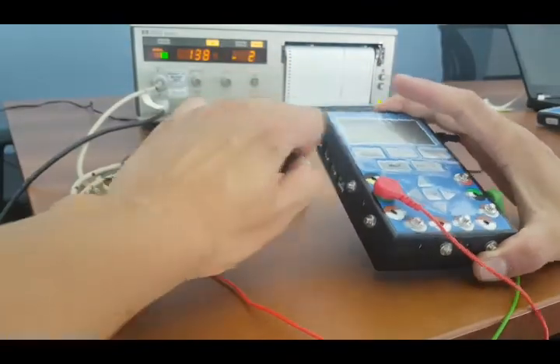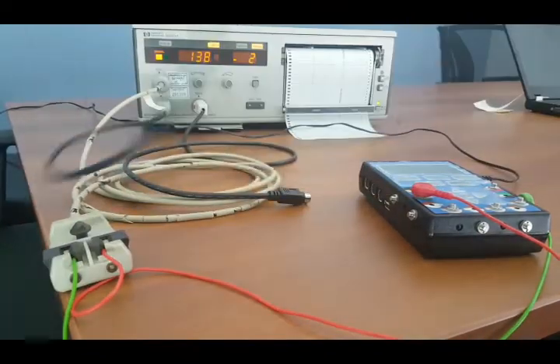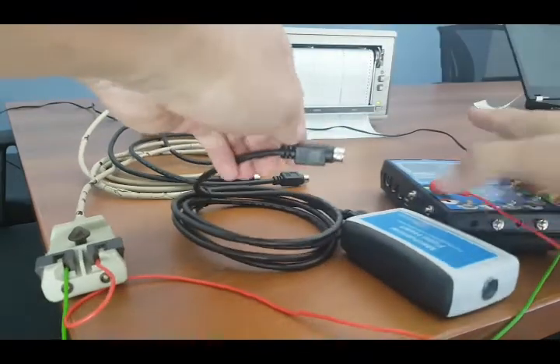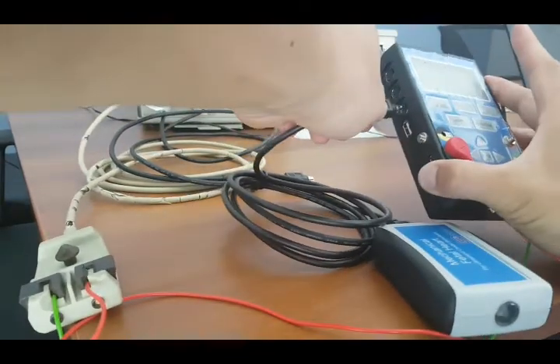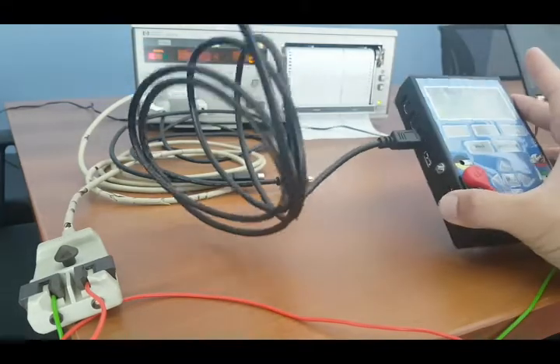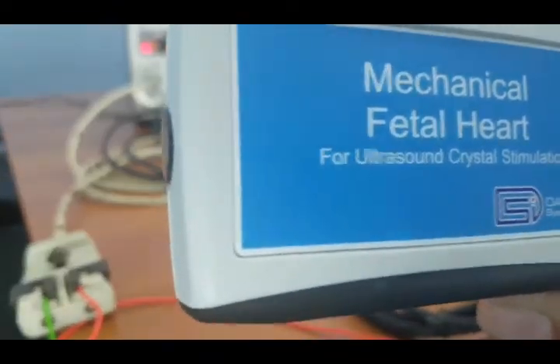Last but not least, I want to connect to my mechanical fetal heart simulator. I'll put these cables aside. So keep in mind right now, I believe I'm running about 140 beats per minute. I will have the mechanical heart very close to the speaker. Hopefully that's going to pick up the sound.